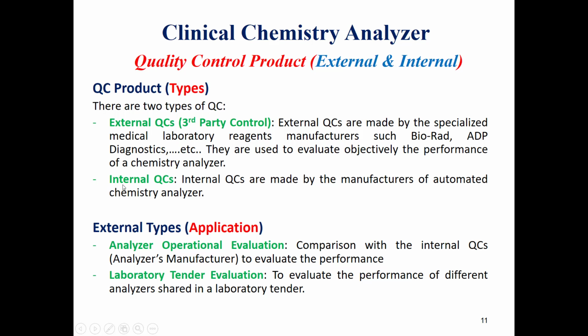And another type will be the internal quality controls, which are manufactured by the manufacturer of the automated clinical chemistry analyzer itself.